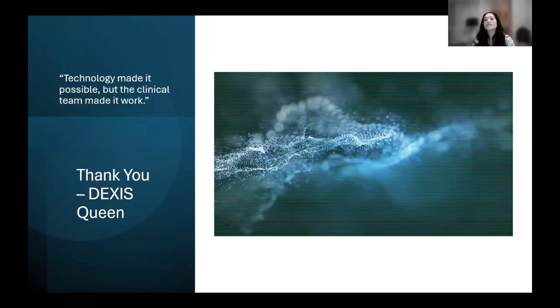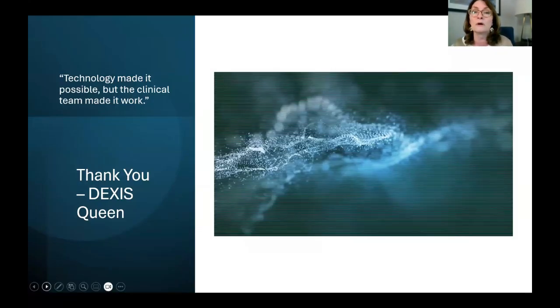Yes, absolutely. And the next question was, could it be just a single little tooth, like on a bite tab? I think it means like when we take a preliminary impression for a temporary. Yes, yes. But you're going to need that light body in there. So you could do a regular tray or a triple tray. But you want to have that light body in there because that's the flowable part. Got it. Any other questions out there, Kelly? Not that I see. No. All right.